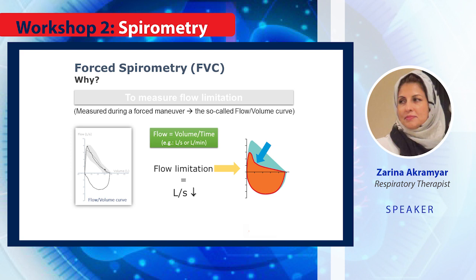Most of the time when they call me, they say, take a look at this test, and when I look at it, I don't even look at the numbers, but just at the flow volume, and I say this patient has obstruction. Sometimes the test looks normal, could be 80%. The patient reached 80, but that doesn't mean it's normal if you look at the flow volume graph and it's still a scoop. Still we give them bronchodilator, and we can see the reversibility.